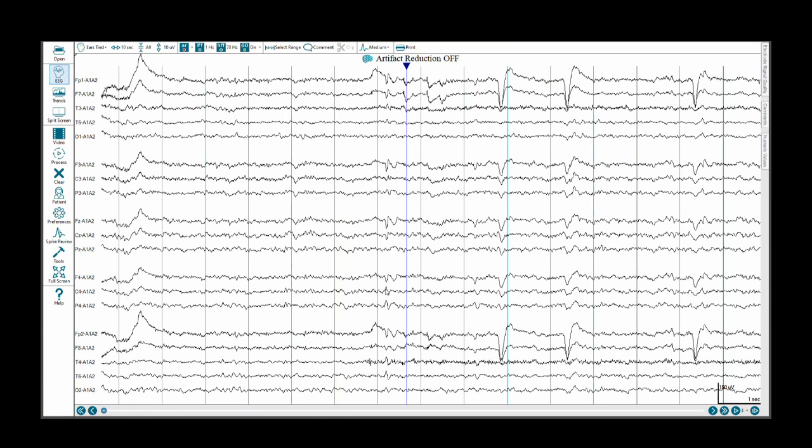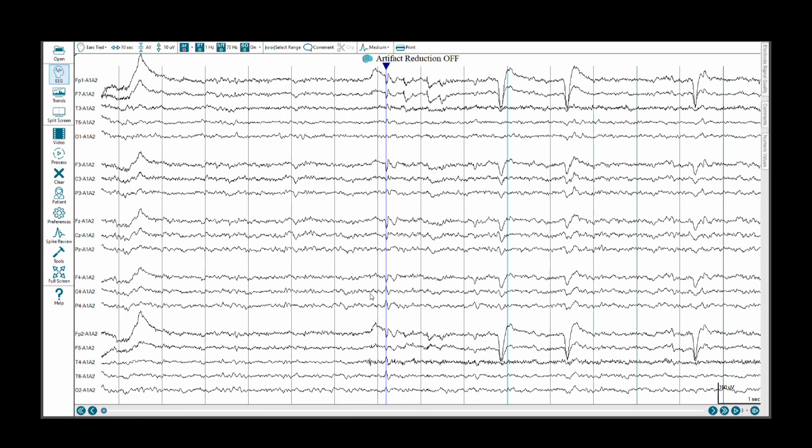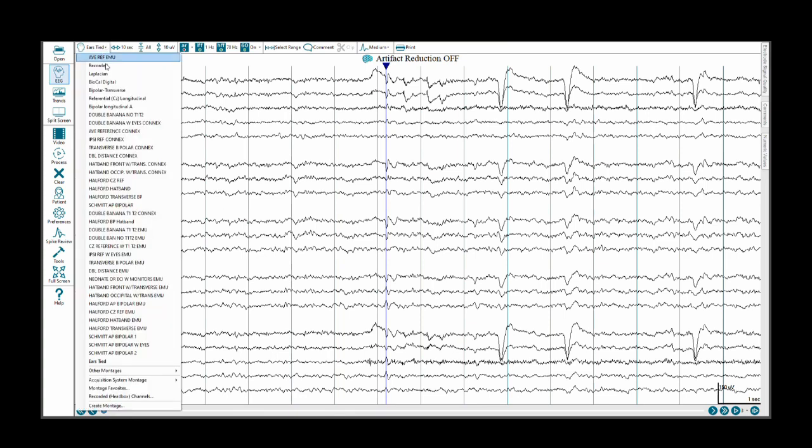We see a positive component to this discharge extending to FP1, F7, F3, FZ, even CZ, as well as F4, FP2, and F8. Now how do we know that this is not contamination? That is one of the reasons that I chose this particular referential montage as opposed to an average reference.